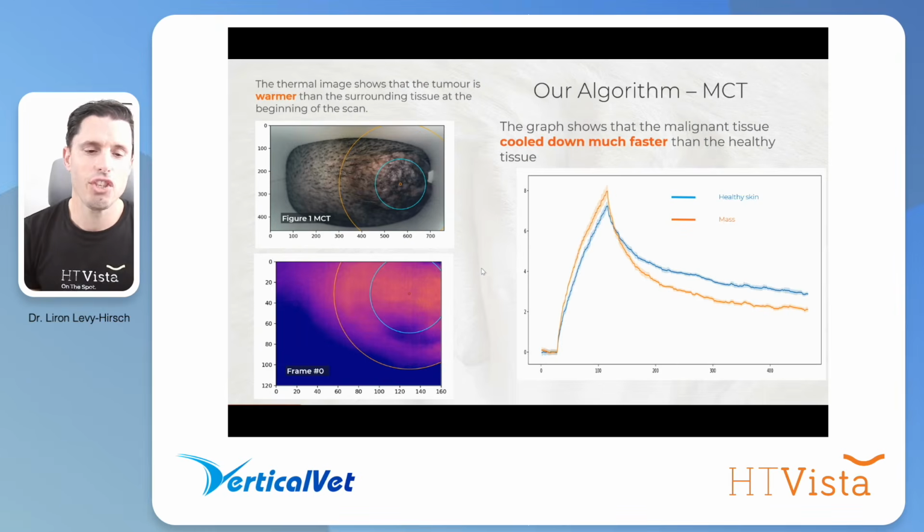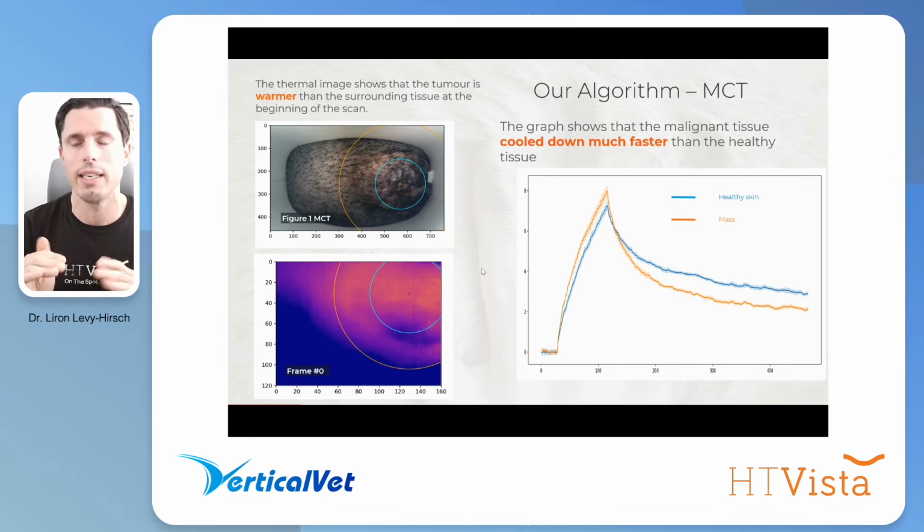Yeah, absolutely. And I think it's probably best if I explain how it works again using the slide that I have. It shows how, for example, we are detecting mast cell tumors. Like I said before, each tissue has a different heat signature. For example, a mast cell tumor has a certain way it warms up, and also quite interestingly, the way the tissue cools down over time. So like you mentioned, the 40-second scan includes 10 seconds of heating, very mild heating, pain-free for the patient, very comfortable, and then is followed by a cooling down period of 30 seconds.